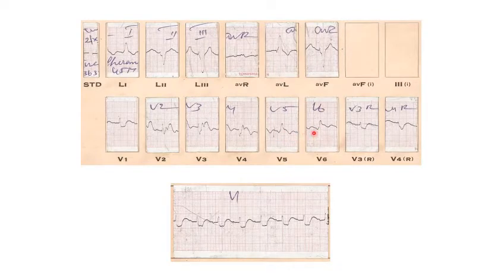Can you get a Q wave in V5 and V6? No. So there is a Q wave in V5 and V6. There's a prominent R wave in V1. The patient has got a previous myocardial infarction, or it could be an evolving anterior myocardial infarction. So this patient has got left bundle branch block, 2:1 block, and evolving anterior wall myocardial infarction.